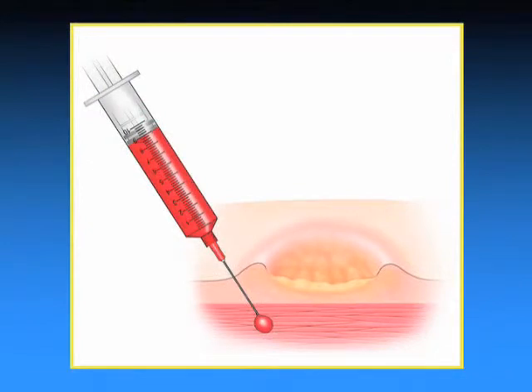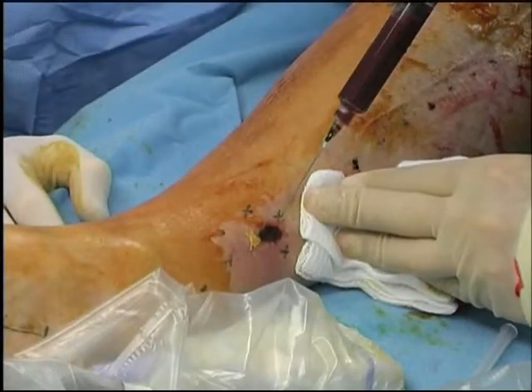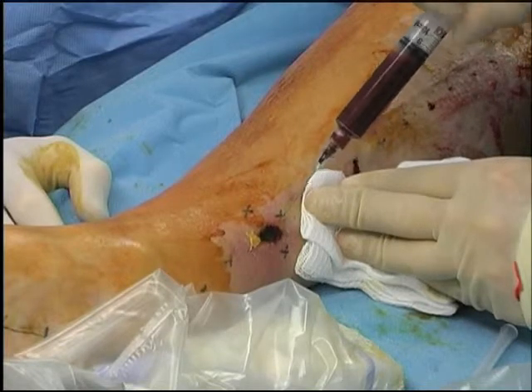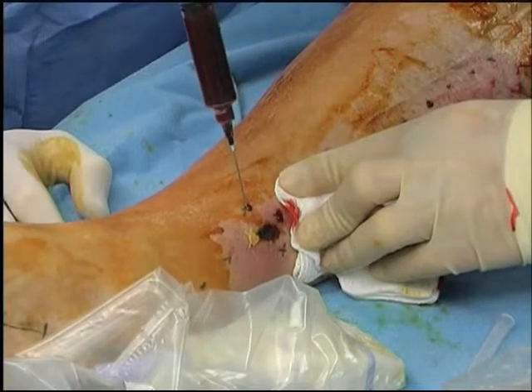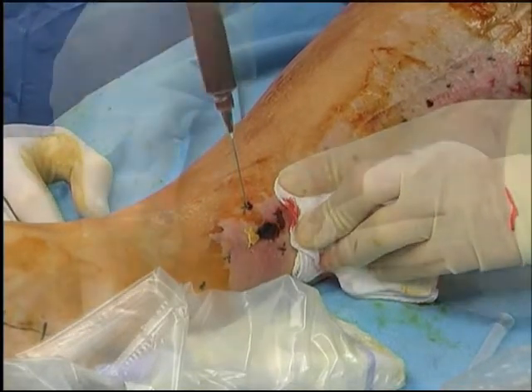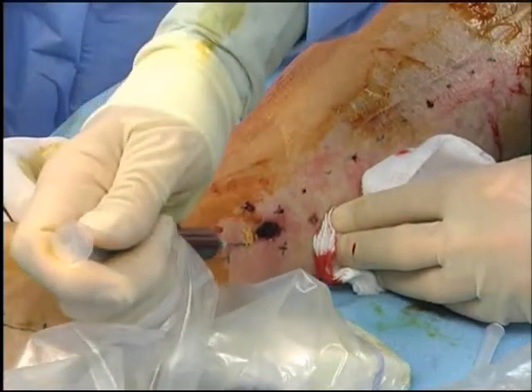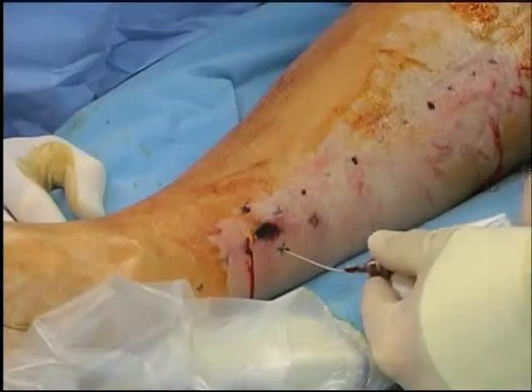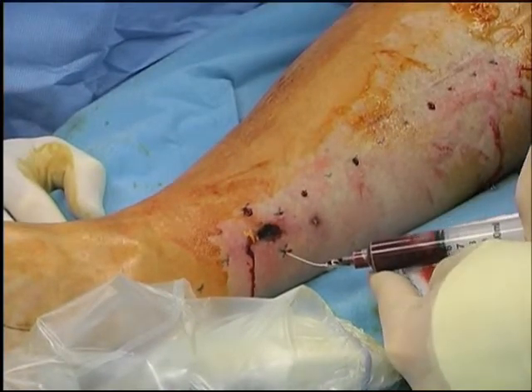When tissue loss is present, several injections around the perimeter of the wound are indicated. Injections should be spread 1 to 2 centimeters apart. The needle will enter the skin 0.5 to 1.0 centimeters from the edge of the wound and extend under the wound bed approximately 80% of the radius of the wound. The injection will be made as the needle is drawn back to the wound edge, delivering a 1 milliliter volume of injectate.